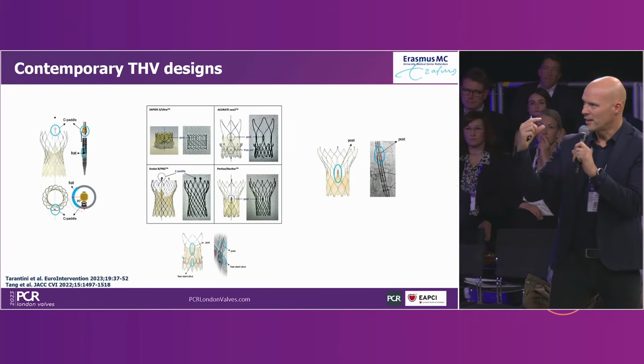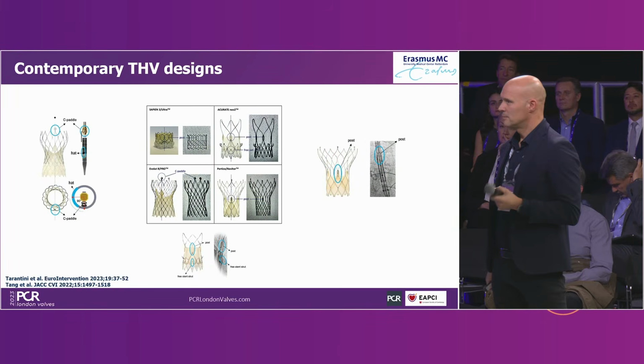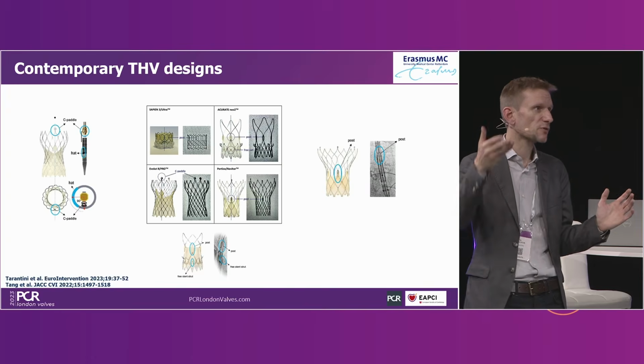Yeah, so relatively red flags are, for me, a coronary takeoff of below 10 millimeters. That is sometimes of concern, but the concern fades out if the sinuses are very wide. Then I don't really care anymore about the height of the coronary. Well, it's not so much for coronary obstruction, but for coronary accessibility, it might still be more difficult, because that's the difference.